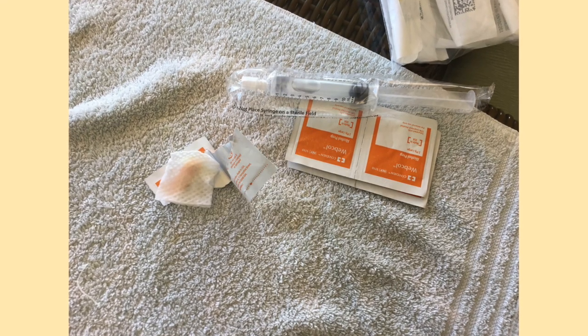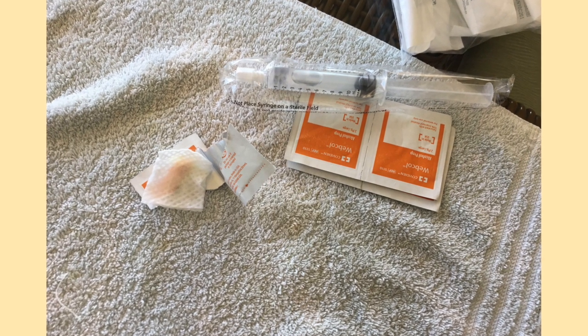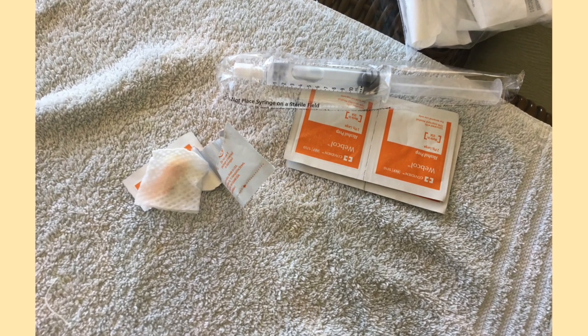Since I have an IV line and receive intravenous nutrition, I have to use alcohol wipes to wipe off the end of my IV line. Once I am done with the alcohol wipe, I then use it to wipe around my tracheostomy tube.